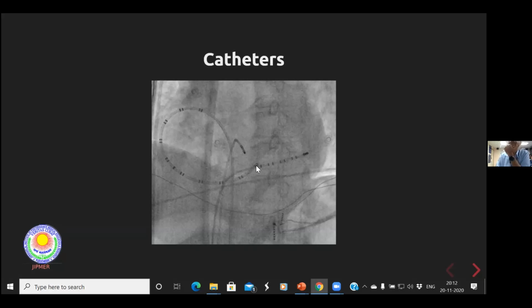Now, placing the tip inside the coronary sinus helps to orient it in the right position, how it should stay. That is one advantage. And the other is when you have it across the line, you have bipoles very close to the line, and that makes it easier to identify isthmus conduction or block of conduction.